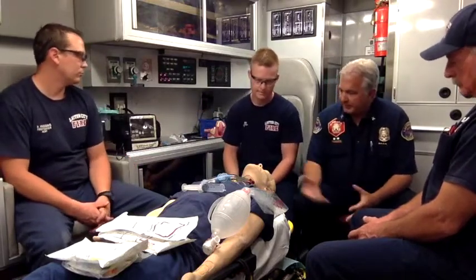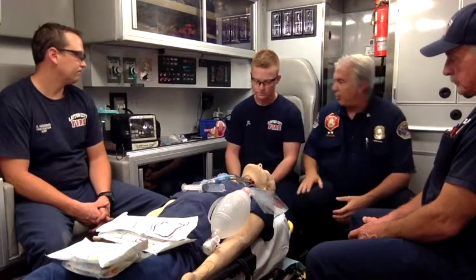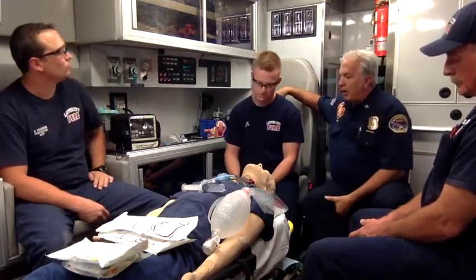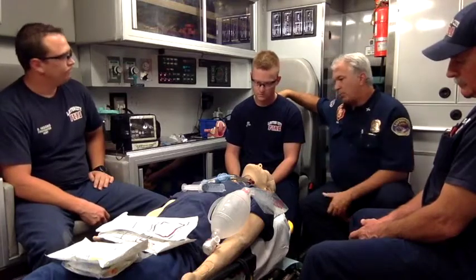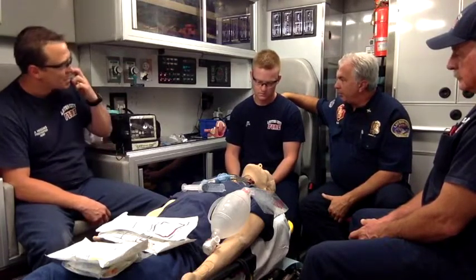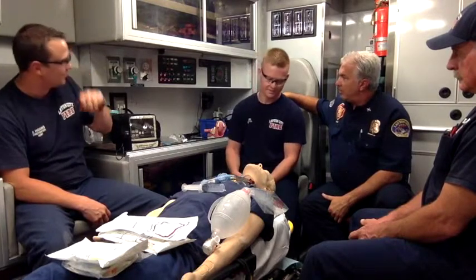So let's say that we're going to put one of these in now. Let's say first of all that we arrive on a cardiac arrest patient. Let's re-emphasize what Dr. Raskovich has asked us to do about cardiac arrest. What are we going to do? Scene safety, BSI.